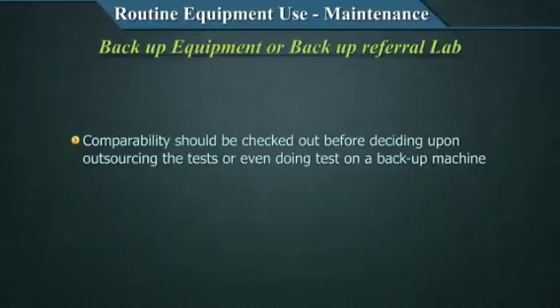So, even if you have more than one equipment in the laboratory which is routinely used, not even as a backup, but you have two equipment and you're using them alternately, so there is no continuity for a patient who's coming. If the reporting ranges are different, you have to be mindful of that.